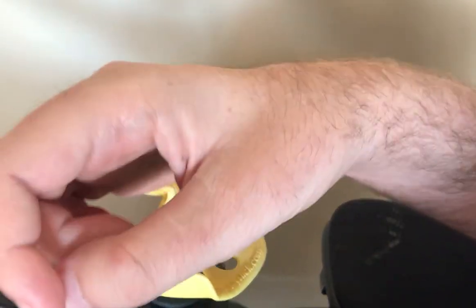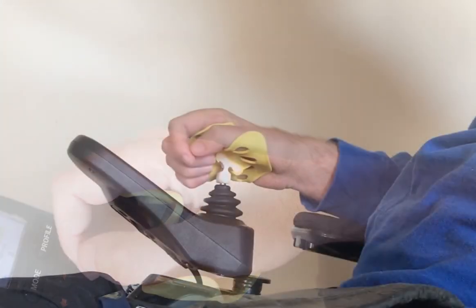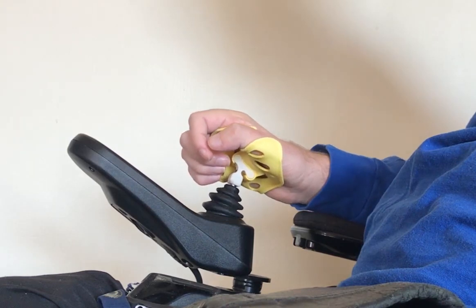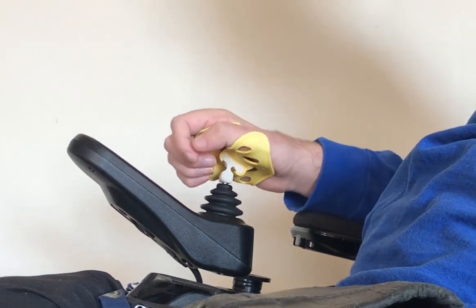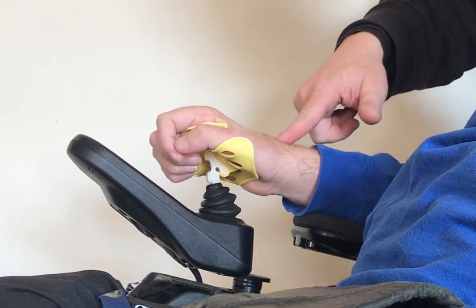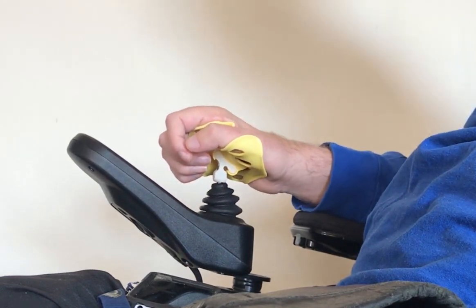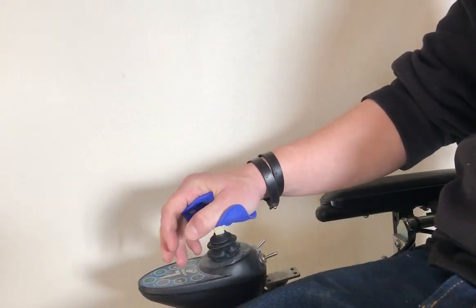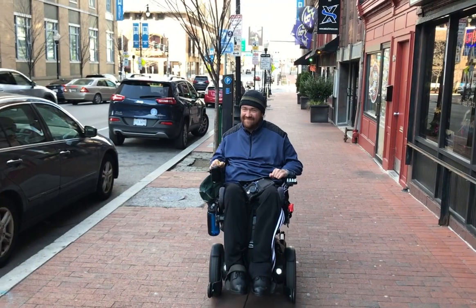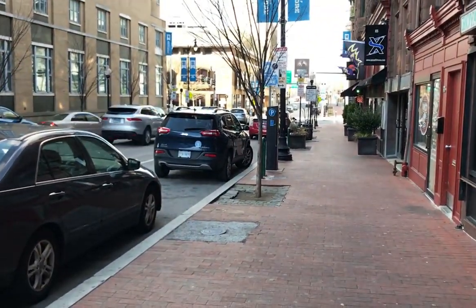This translating movement isn't always intuitive. After years of driving, the habit of rolling the wrist with the handle becomes a reflex. If you notice it when you try the handle with a client, you may want to lightly touch the top of their wrist to let it know that for the first time it can stay straight. Also, tell them to relax their fingers and let the handle do the work. After a few minutes of driving, you will recognize this is how driving a chair was always supposed to feel.